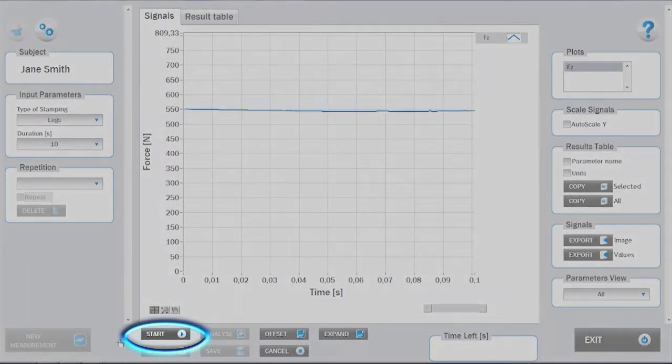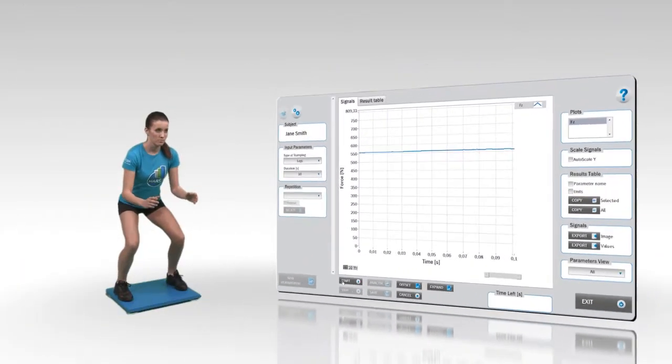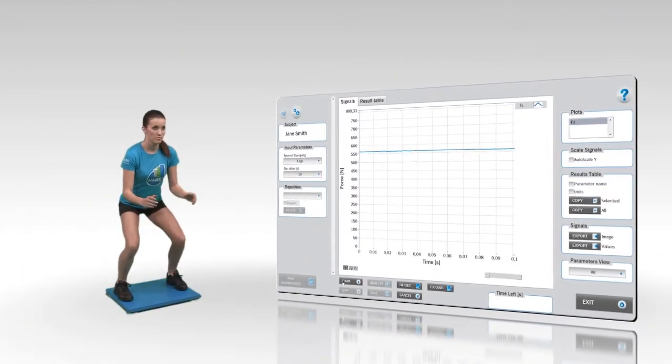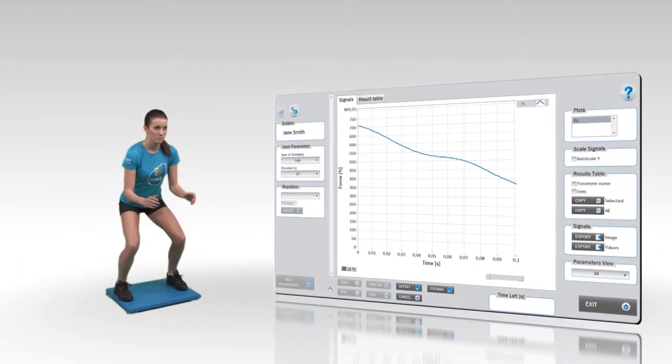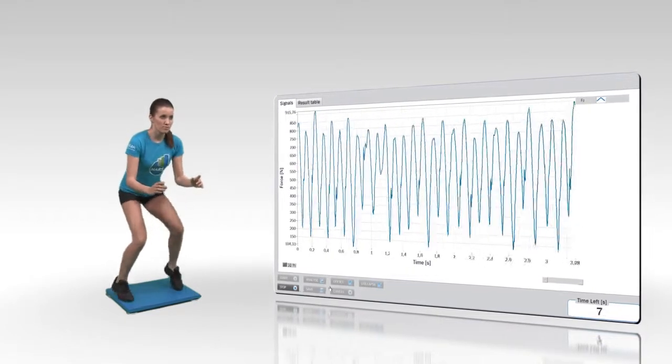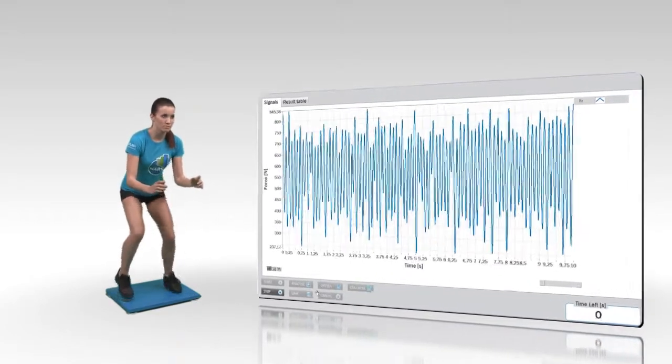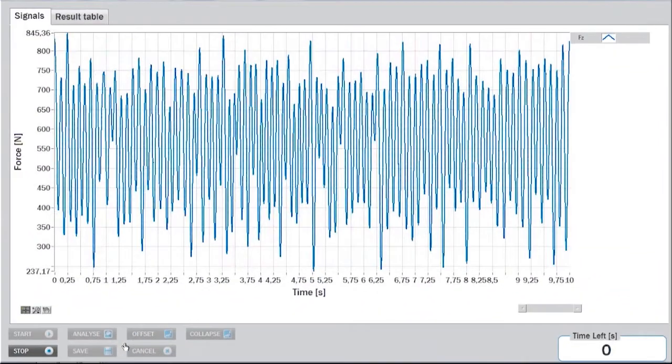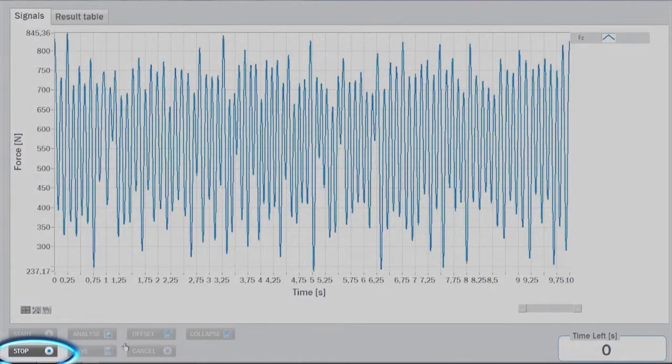Initiate the measurement by clicking the start button. The measurement stops automatically after completing the task. It can also be stopped manually by clicking the stop button in the lower panel.